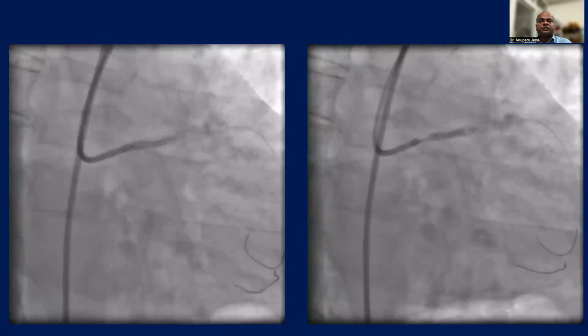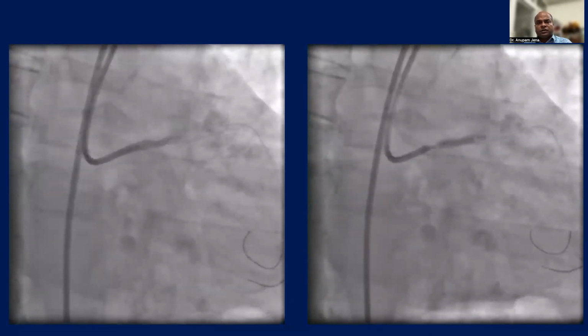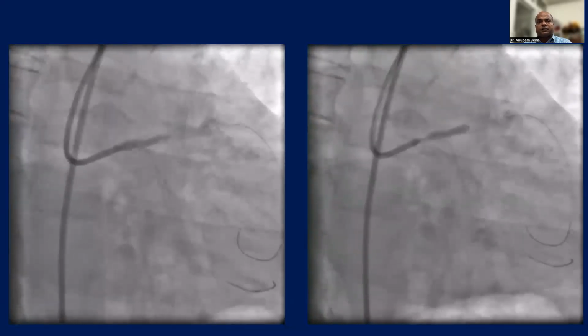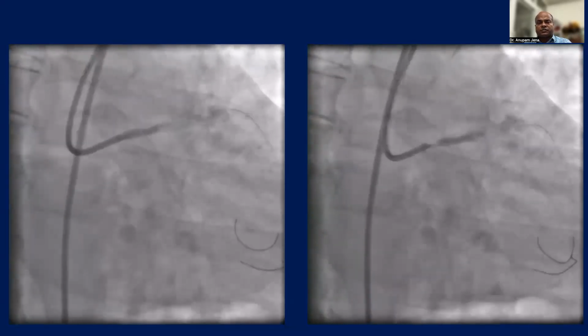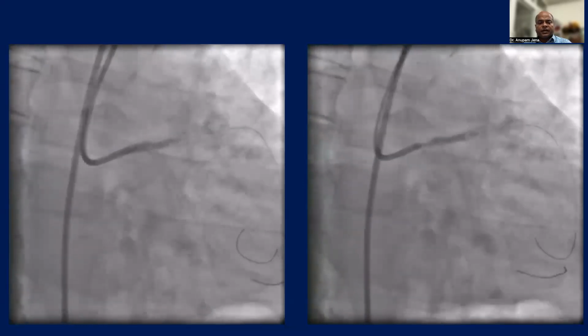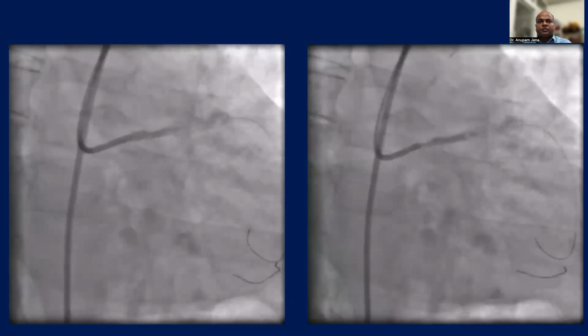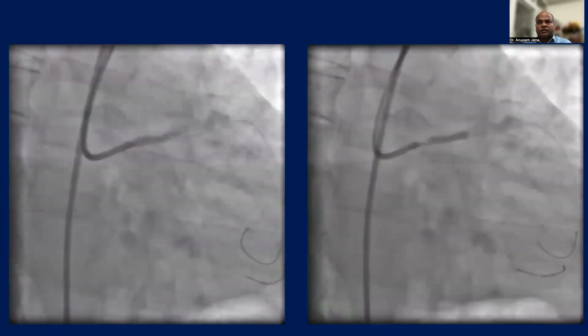That's why in all left main lithotripsy cases, we normally give five pulses, then go to 6, then come down, so that there is a rapid inflation and deflation mechanism. In that way, we can prevent unnecessary or prolonged myocardial ischemia.